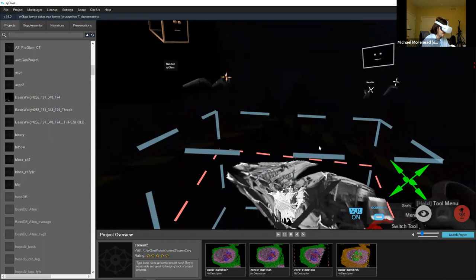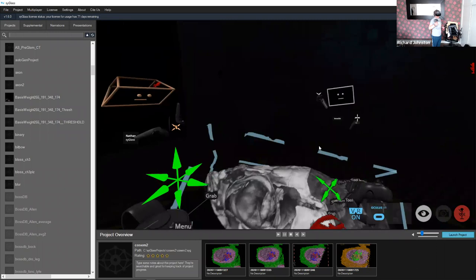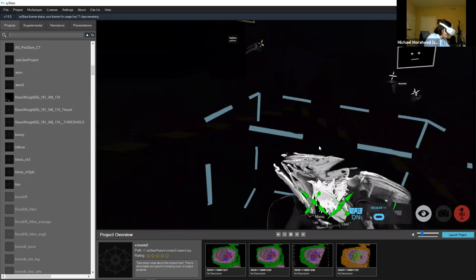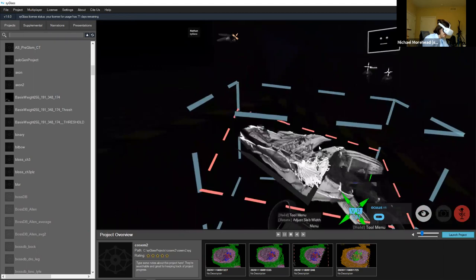The gills are also nicely thresholdable — a very complicated structure that's hard to get at in 2D but a big time saver in 3D. You get the context of the shape: in 2D a fiber next to muscle tissue might look like gills because they both look like fibers, but in 3D the context makes the distinction much clearer.